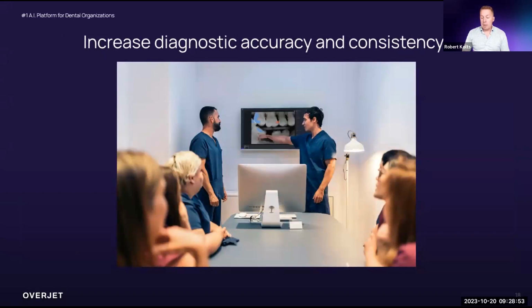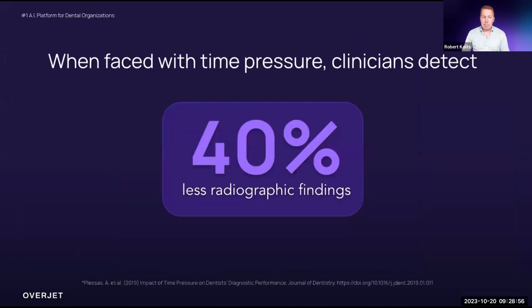When we talk about accuracy, there was a really interesting study that came out in 2019 that looked at the impact of time pressure on a dentist's ability to diagnose accurately on a radiograph. And it was really fascinating. What they did is they split the group of dentists into two cohorts. One of the cohorts had unlimited time. Look at this x-ray, come up with your diagnosis. The other cohort had a finite amount of time. So imagine a countdown timer in the top corner of the screen, counting down 30 seconds. And after the timer hits 0, it goes to the next x-ray and you have to come up with your diagnosis. And what they found is that clinicians, when under time pressure, will diagnose 40% less radiographic caries than clinicians without time pressure.